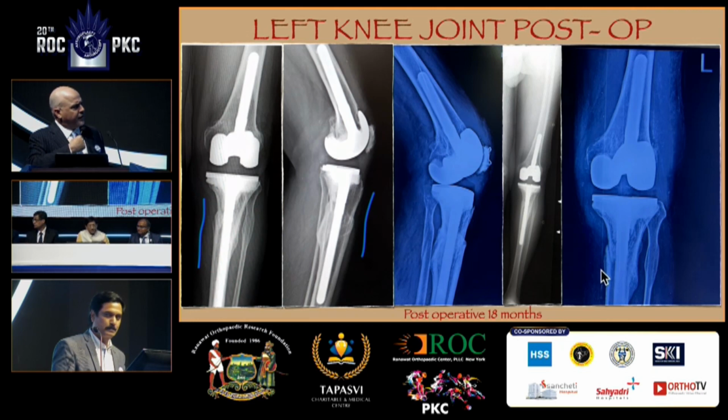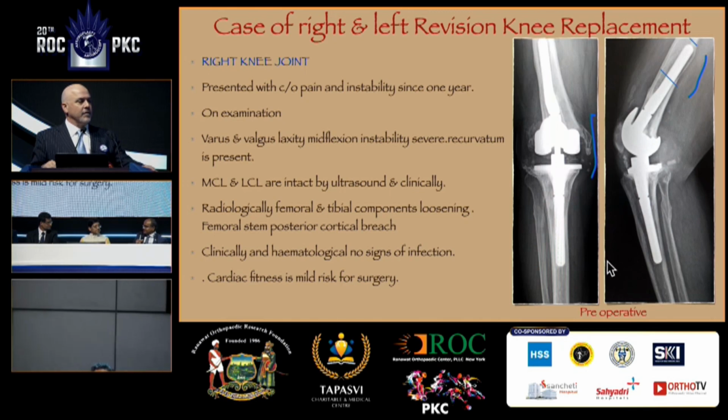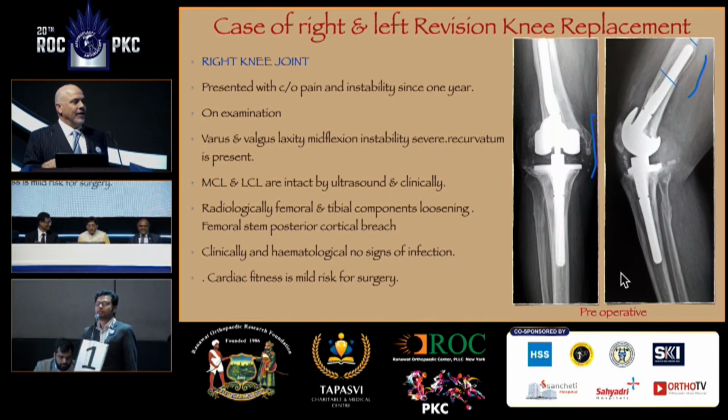He's beyond it, I think, far enough. I don't have a problem with the length of the tibial stem. It's small. It's not engaging the cortex there. As per Dr. Ranawat, that success cannot be challenged. Exactly. Good that it has healed. Patient is lucky. All right, anything else to add?